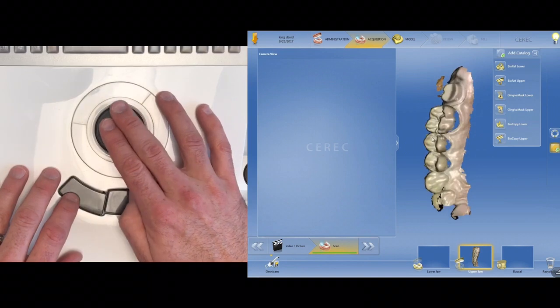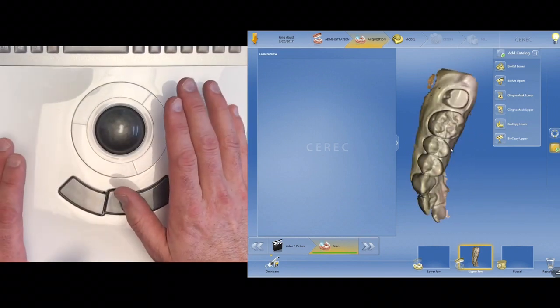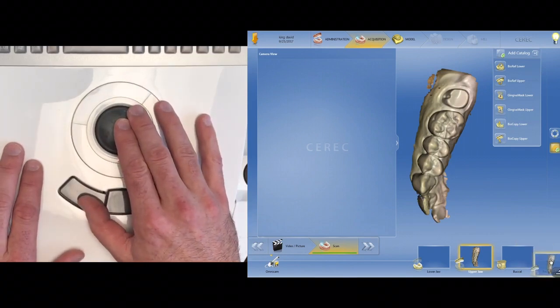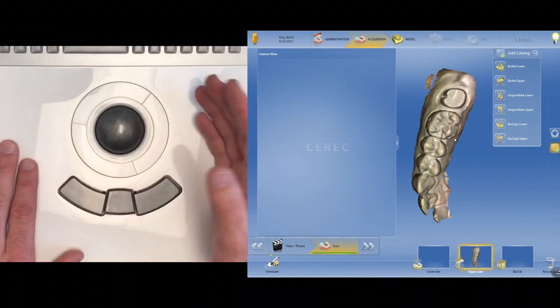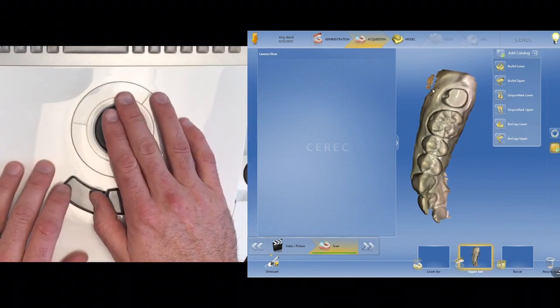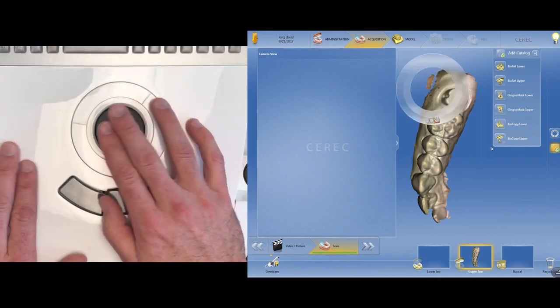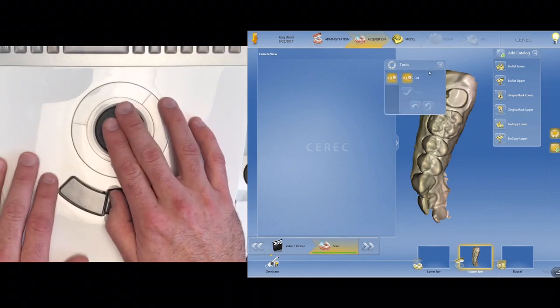All right, so let's say I did not like this image. So I have a couple of choices. Choice number one, I can delete this image. Just drag it over to the recycle bin and delete it. Choice number two is I can cut some of the image out. So let's say I want to cut that out. I can right click and you get the toolbar, or you can go over here and you can cut as well.